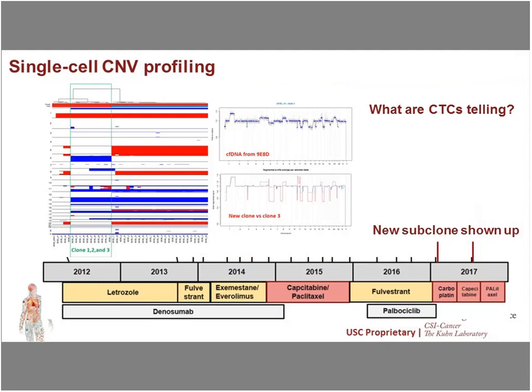So this patient remained very genomically stable, consisting of only 3 subclones over 4 years, until the second chemotherapy treatment. Clone 4 was discovered for the first time with a predominant proportion in draw 16. And at that time, she was progressing on both hormonal therapy and chemotherapy.